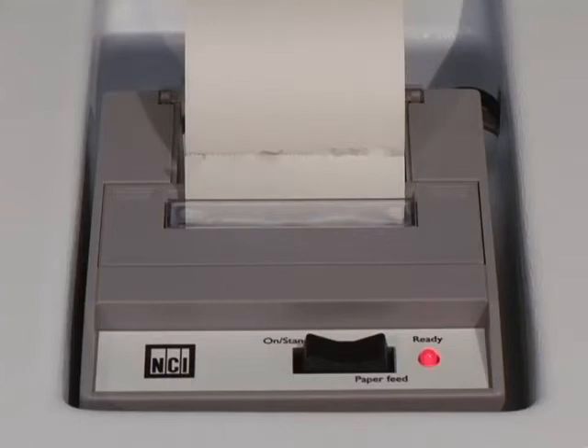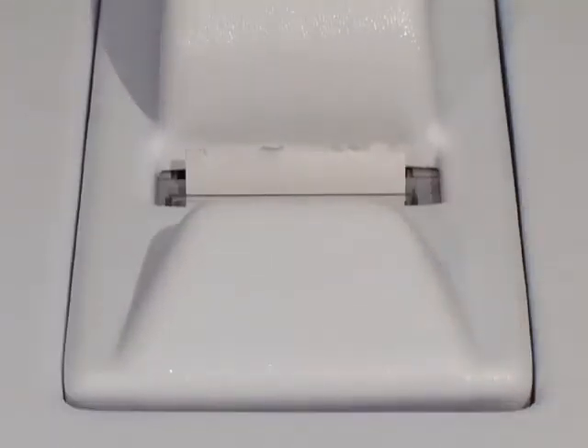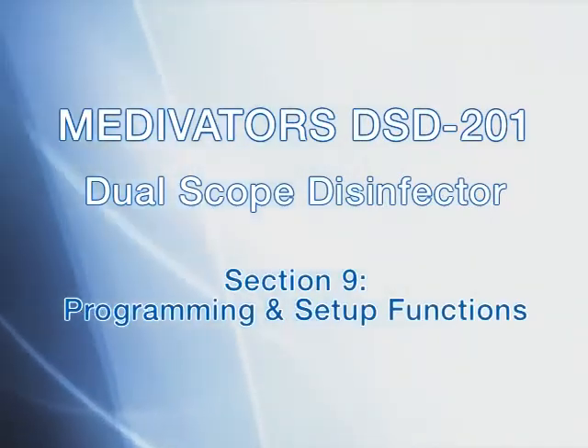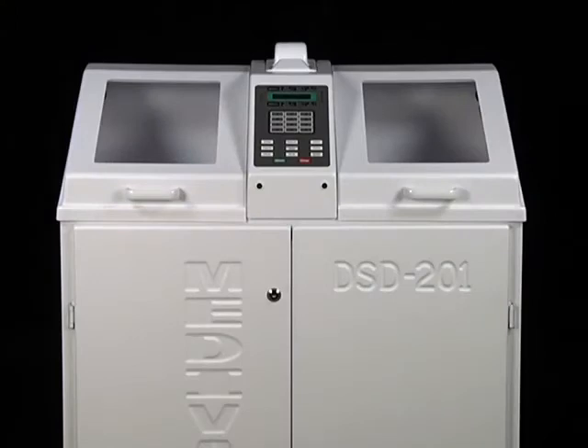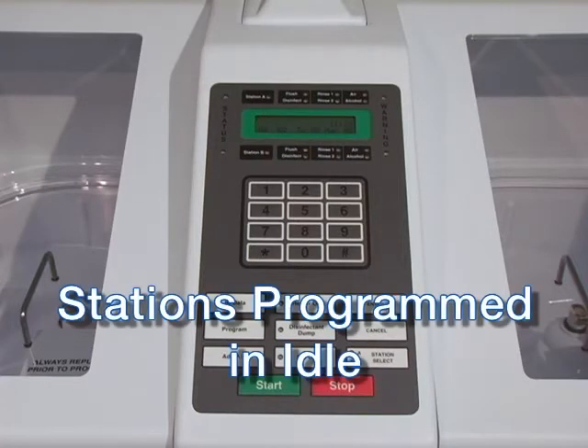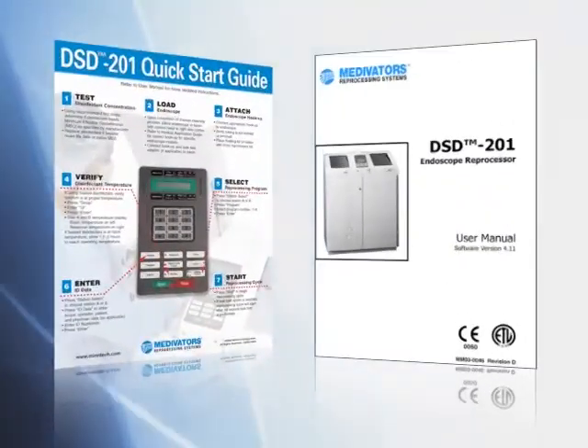This concludes the section on routine maintenance of the DSD-201. In the next section, we will demonstrate how to program the unit. This section will demonstrate the procedure for programming your DSD-201. We will review how to set the system's time and date and how to program a disinfection cycle, then look at some common setup functions that can be activated from the keypad. These procedures should be performed while the disinfection stations are idle. The instruction manual and the quick reference guide are both useful guides containing all these steps.